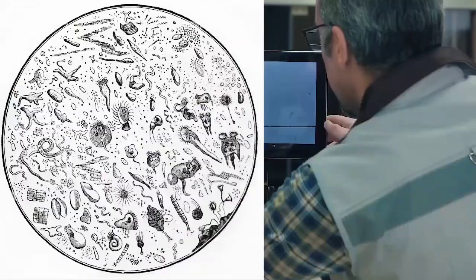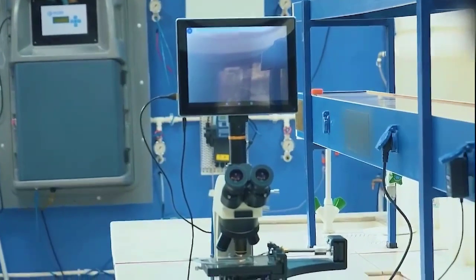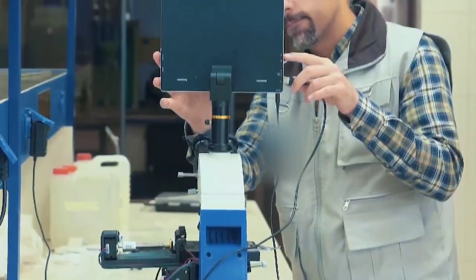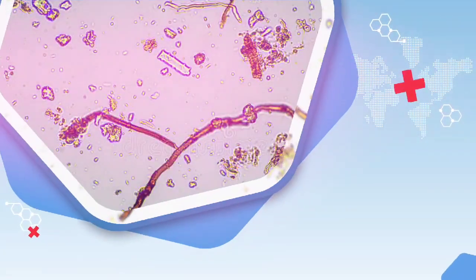Water facilities can utilize MicroID for both online and offline monitoring of water quality and safety, enabling them to remain vigilant against possible contaminations. Additionally, MicroID can be connected to WaterSys, an intelligent water sources and supply management system.